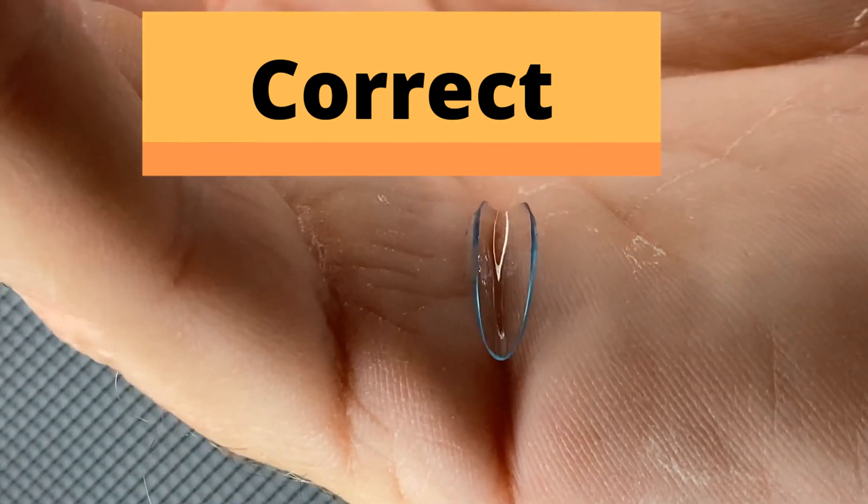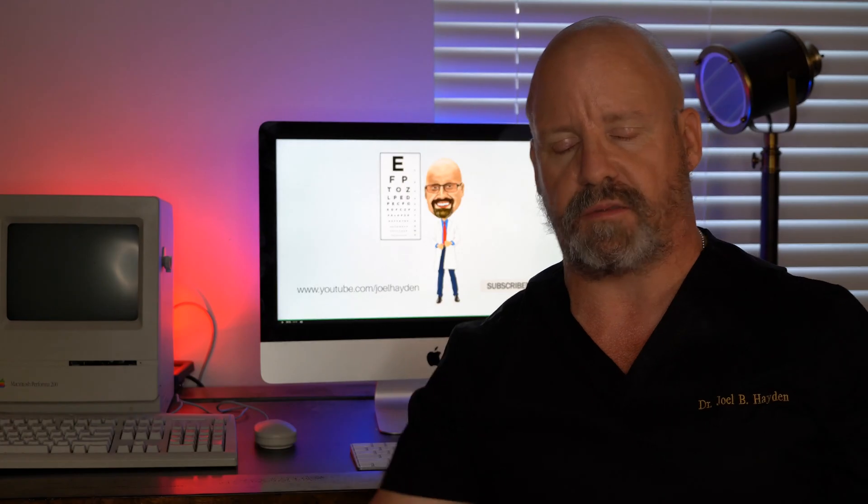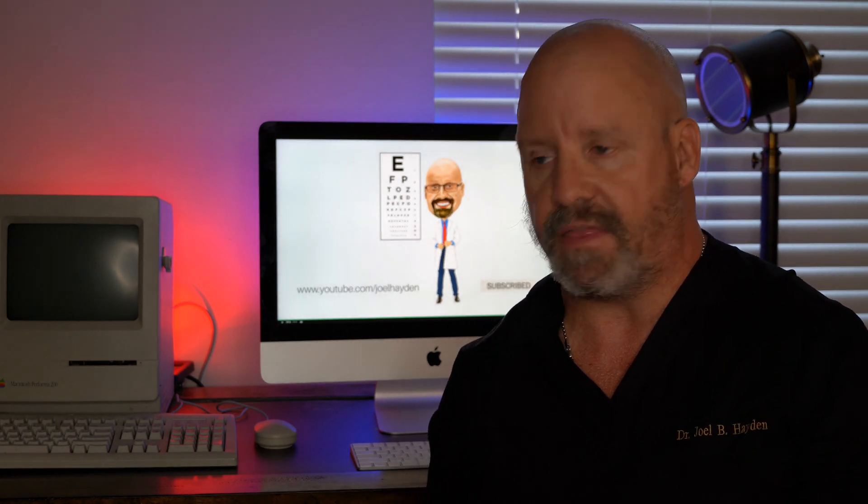I've found the taco method to be the easiest, and I think across all manufacturers that is the easiest way to tell. The third way is trial and error — put the lens in and blink a few times. If you feel it more than you should, or if it feels like it's moving more than it should, it's inside out. Remove the lens, flip it the other way, put it back in, and you'll find it's more comfortable when it's sitting right.